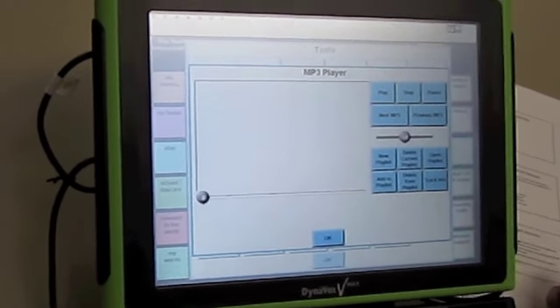Once I did reach the Dynavox software where I needed to call, I sat on hold for about 15 minutes before I eventually gave up. There are other options in finding technical support for the device. They really recommend using live chat options on their website, and there also is a question and answer forum on the website.